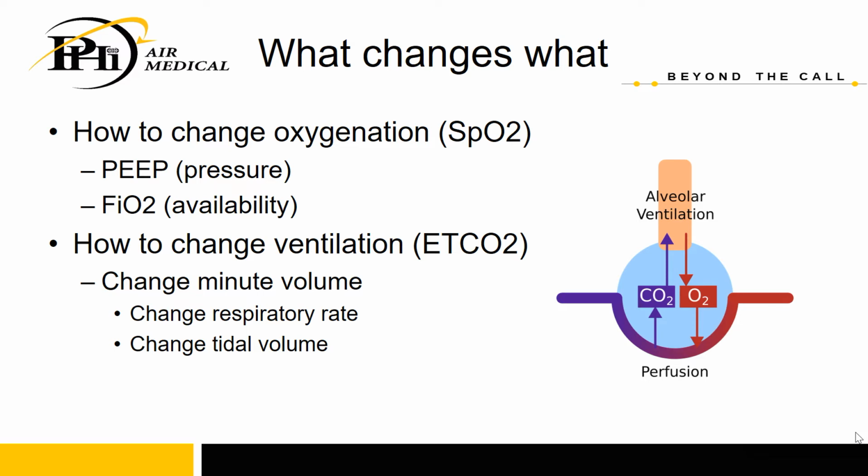We're going to typically just increase their respiratory rate in order to blow off more of that CO2, and that is perfectly fine and dandy, and that's what we're going to continue to do for the most part. However, in your conscious pressure supported patient, like your BiPAP patient, you can't just tell that patient to breathe faster, right? They're not going to do that effectively for you, and even if they do try to do it, they're not going to keep it up for very long before they get tired of it. So we can't really manipulate the respiratory rate to adjust their minute volume.